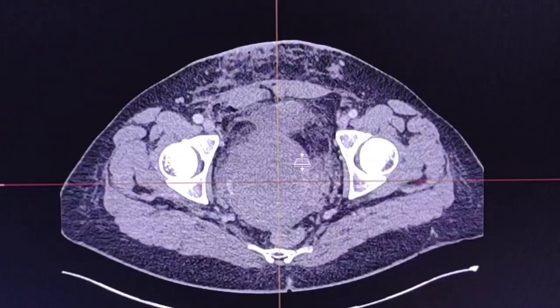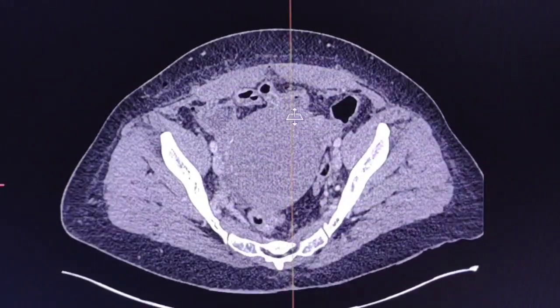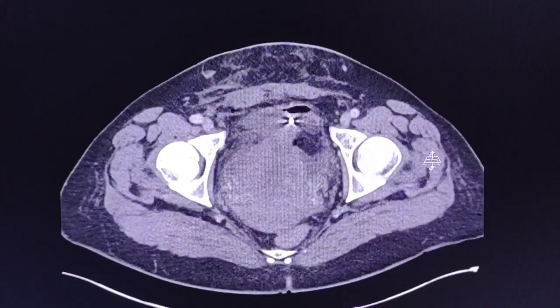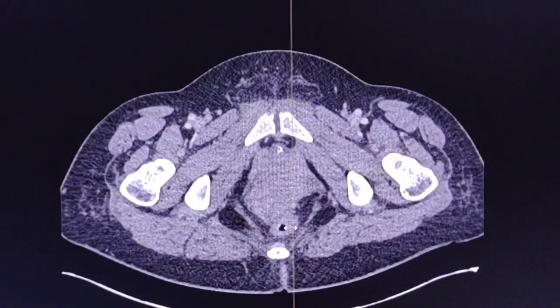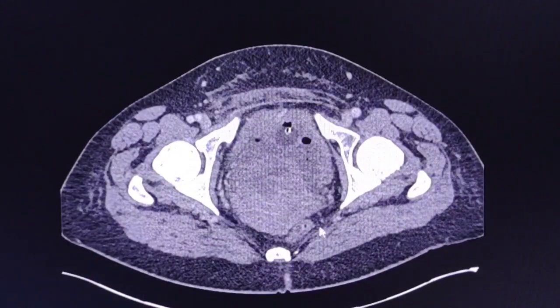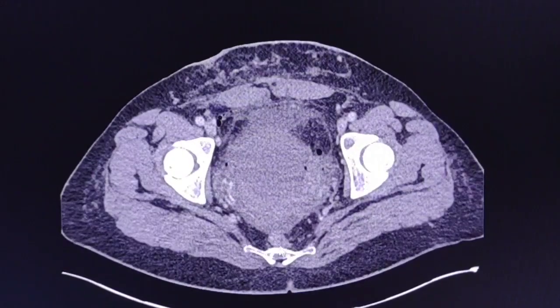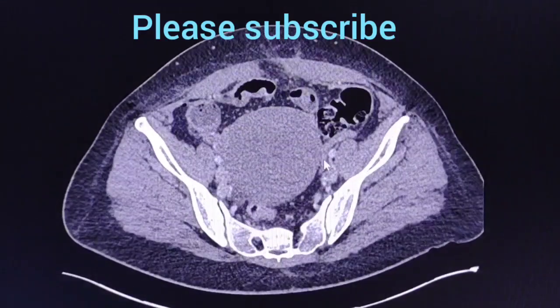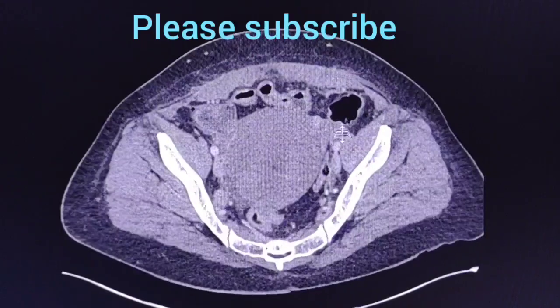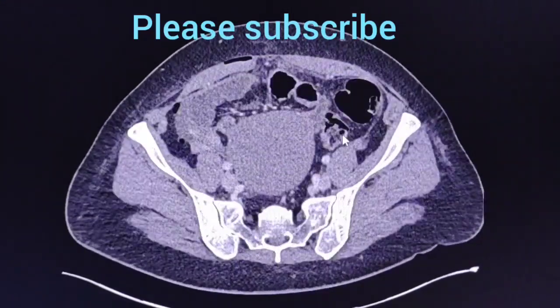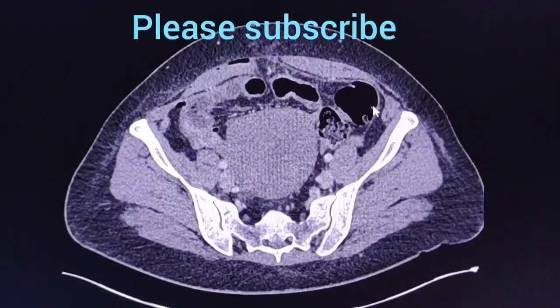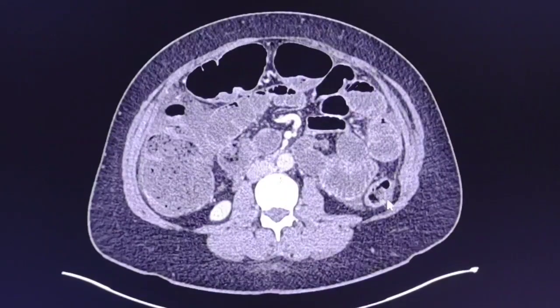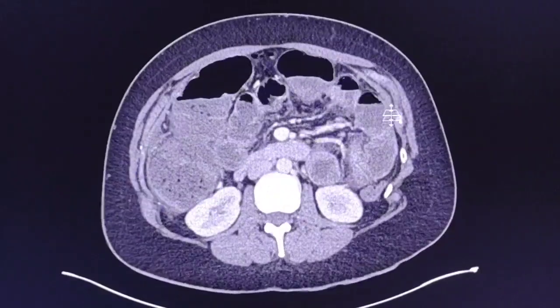Here is the uterus. Starting from the anorectal region, we can see that there is normal caliber — there is no dilatation at this point in the sigmoid. Just follow my arrow — there is mild dilatation here, not something significant. This is the descending colon here, almost collapsed.